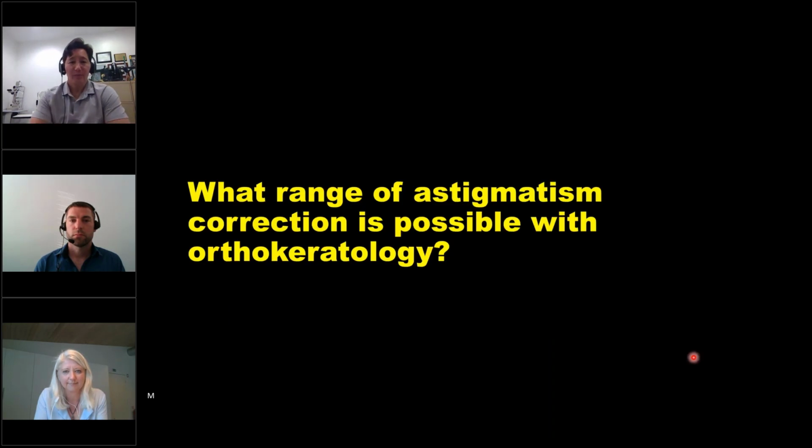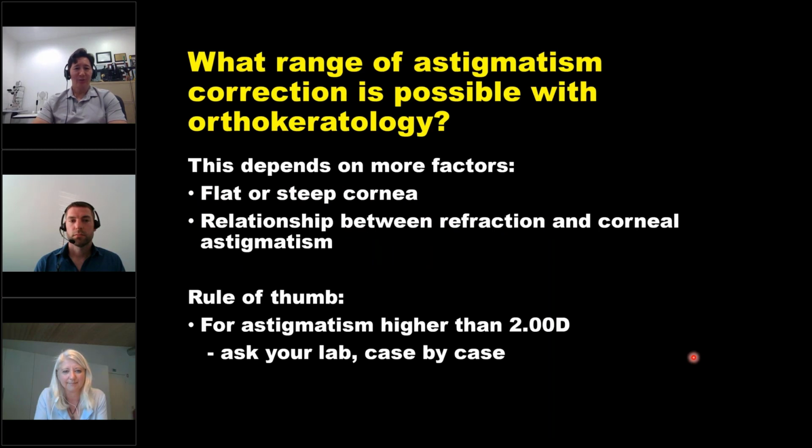This was a great question. What range of astigmatism correction is possible with orthokeratology? And I'm super interested in Mette and Nikki's thoughts on this question. Mette, could I start with you? Give us your thoughts about astigmatism and Ortho-K.